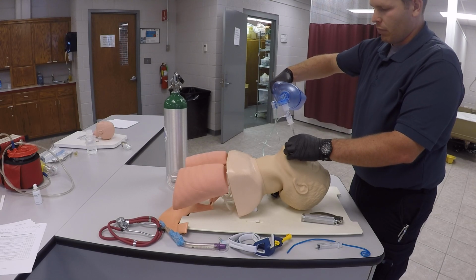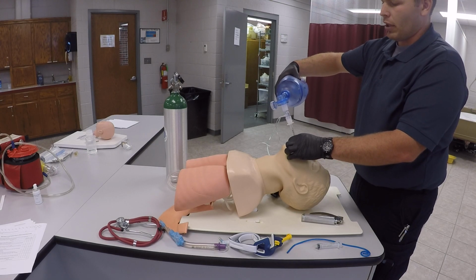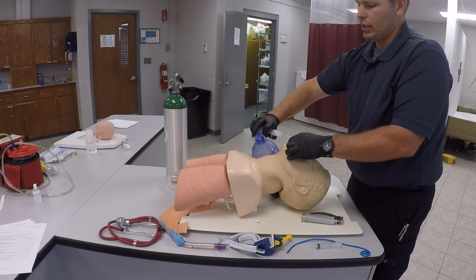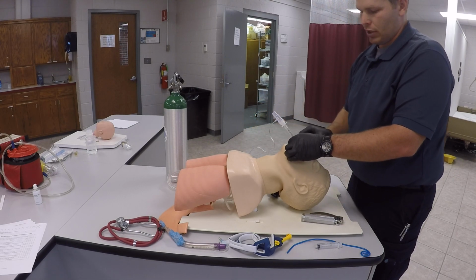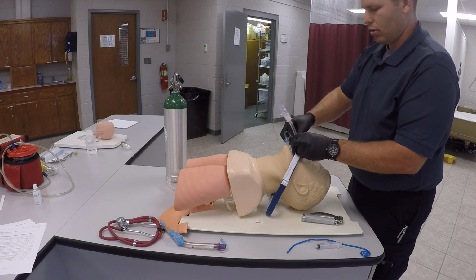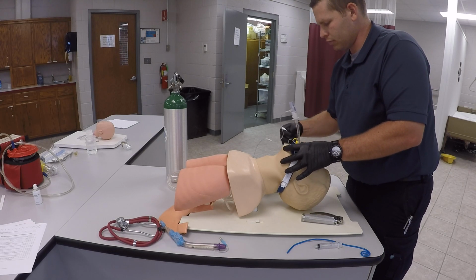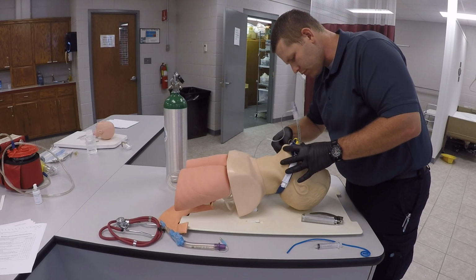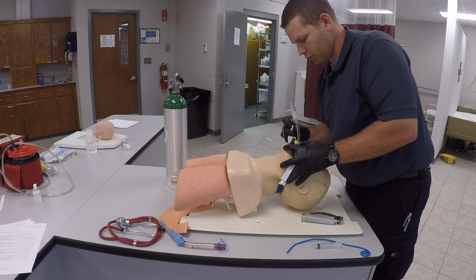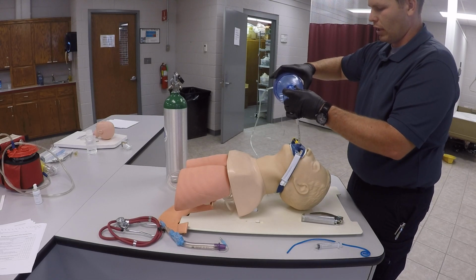Alright, we're all good there. We're going to make sure our ETCO2 is all good and that we are getting a positive waveform there. And then we'll go ahead and secure our ET tube while our partner continues to oxygenate the patient. Nothing has shifted after we've done that.